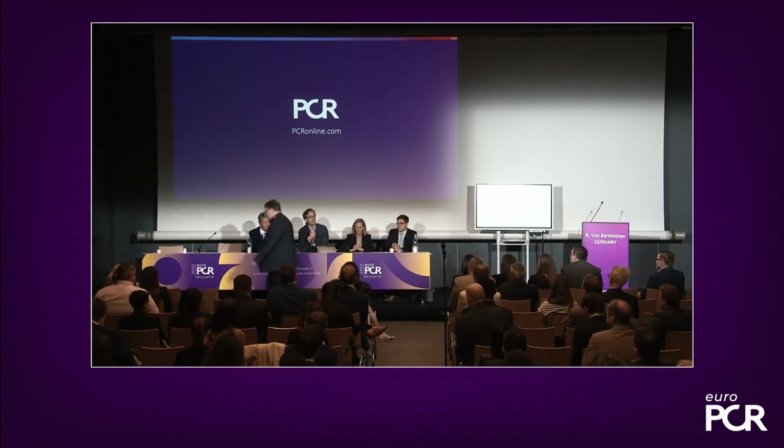That's a very nice demonstration. I think edge-to-edge is probably one of the most challenging procedures with ICE, because you really need to see both leaflets at the same time. And that's why the second plane or 3D, as you nicely demonstrated, is extremely important.